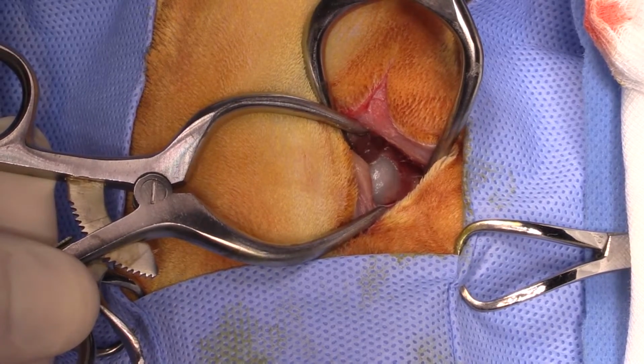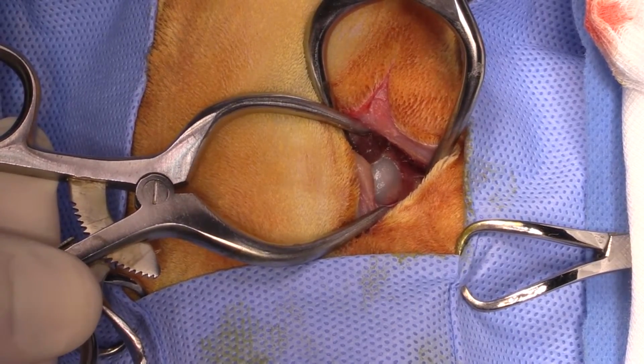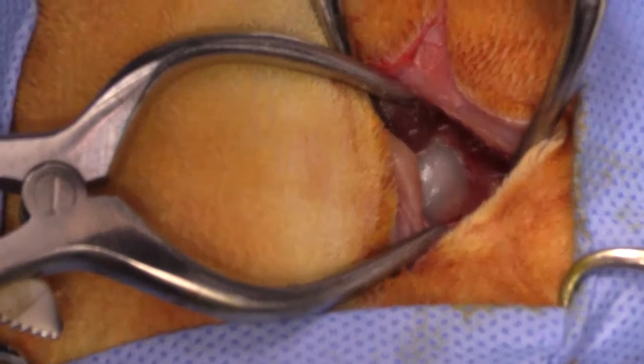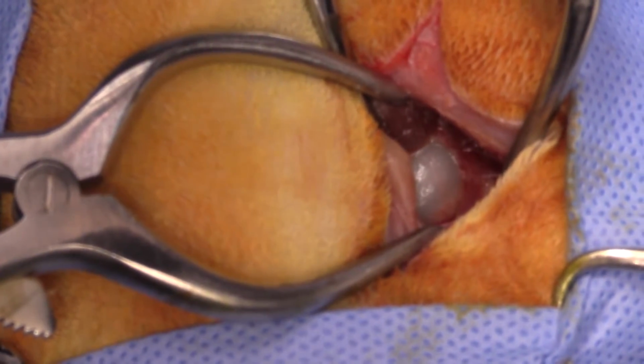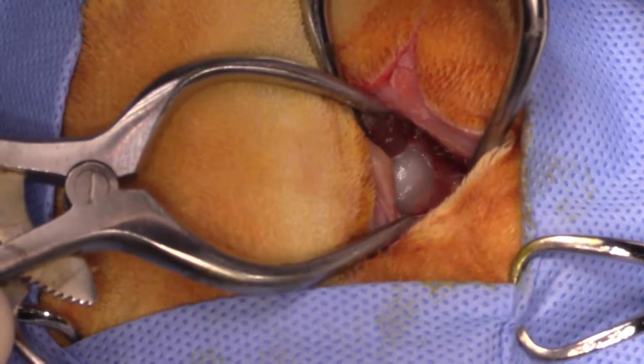Let's see if I can zoom in here a little bit more. There we go. It might be a bit too far. There, that's great.